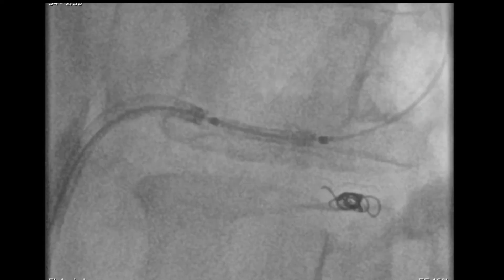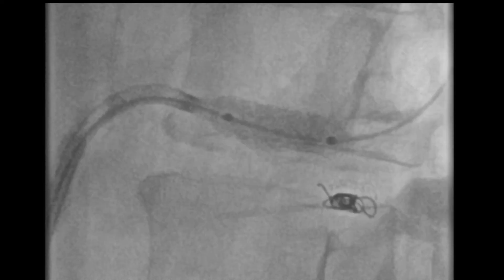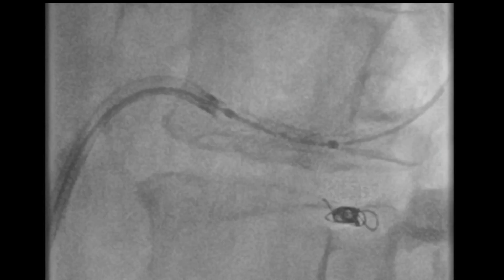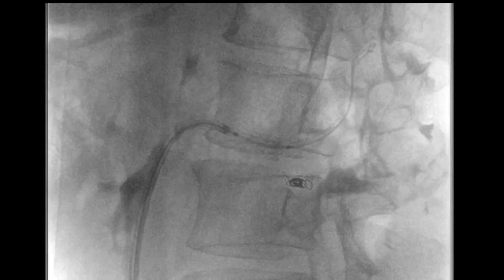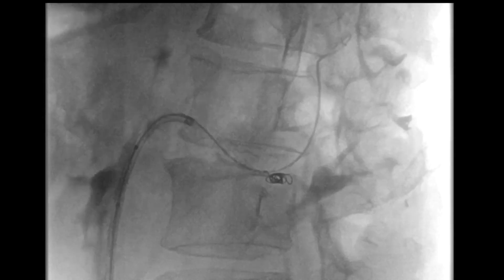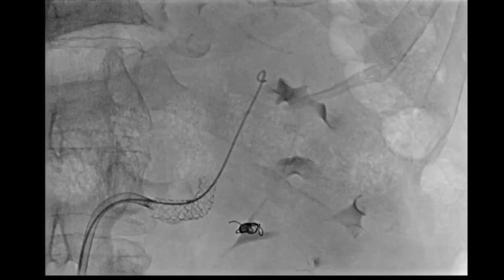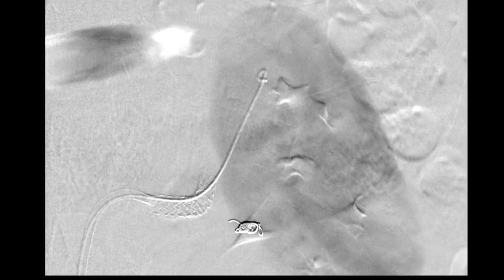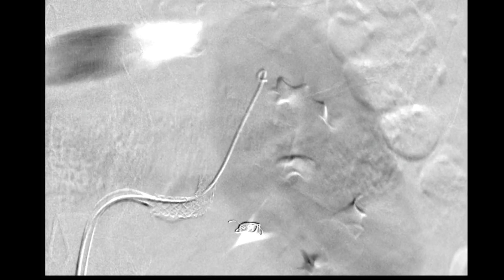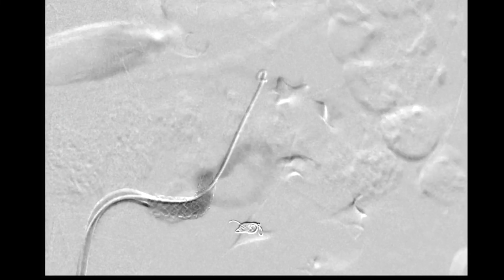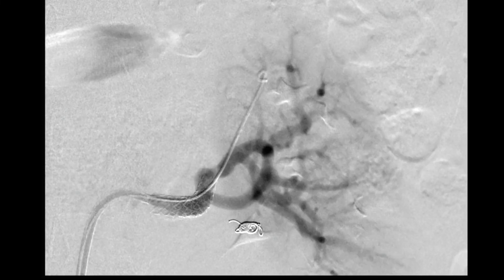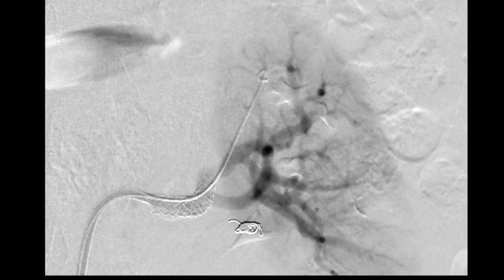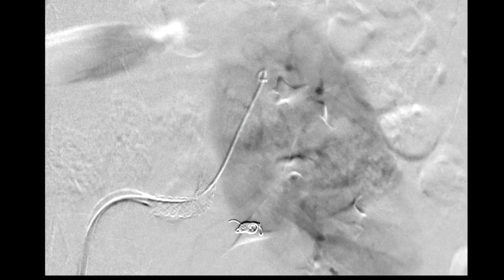Once this stent is deployed, we proceed with our completion angiogram that demonstrates successful exclusion of the renal artery aneurysm and no evidence of endoleak. This concludes our demonstration of endovascular repair of renal artery aneurysm.